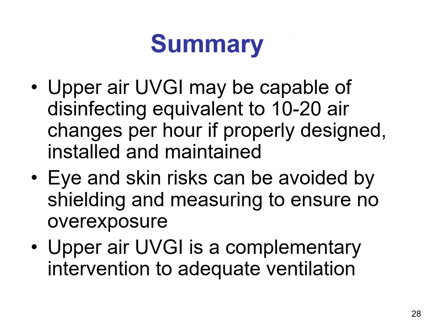To summarize, upper air UVGI may be capable of disinfecting equivalent to 10 to 20 air changes per hour if properly designed, installed, and maintained. Eye and skin risks can be avoided by shielding and measuring to ensure no overexposure. Upper air UVGI is a complementary intervention to adequate ventilation.